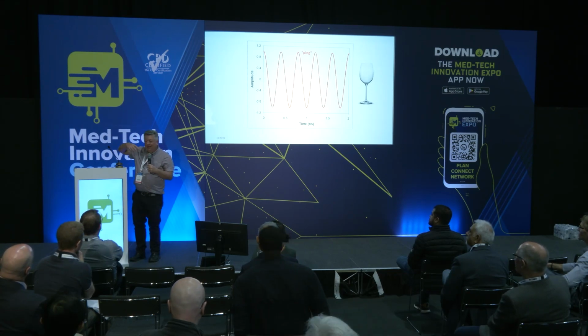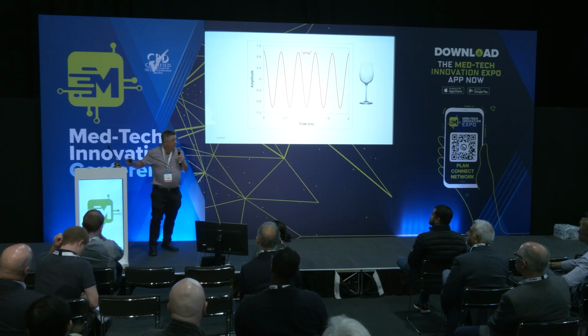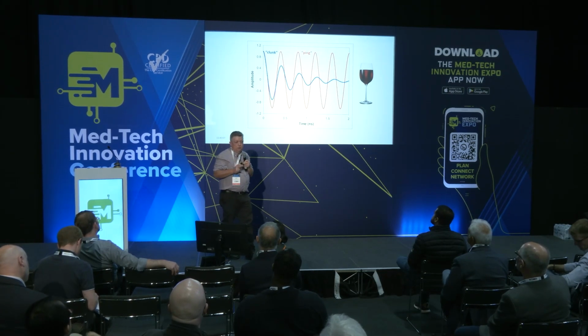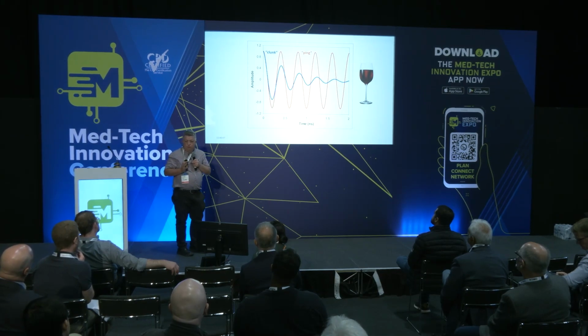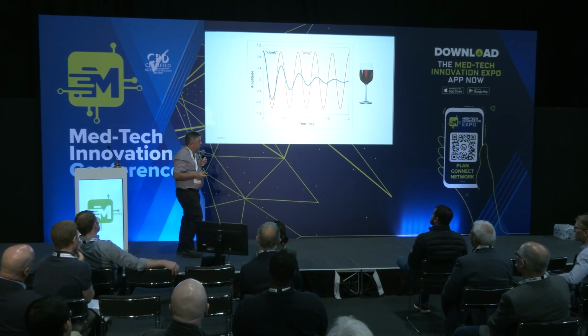I haven't got enough hands for this, sorry, but I thought I'd have a wearable mic. If I touch the bell and ping it, then listen to the difference. Technically, that's called a clunk. And if you look at a clunk, the oscillation decays much more rapidly. Now, what we're doing is we're not using acoustic resonators, we're using electromagnetic radio frequency resonators, which are quite small, okay? They can be packaged so that you can wear the things.